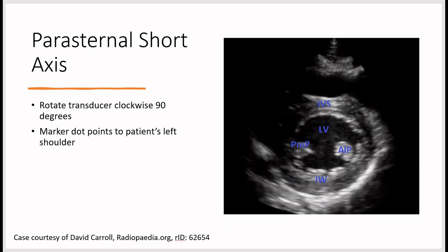For the parasternal short axis view, rotate the transducer 90 degrees clockwise from the parasternal long view, with the probe marker pointing to the patient's left shoulder and appearing on the right side of the screen. Structures visible include the interventricular septum, left ventricle, inferior wall, anterior lateral papillary muscle, and posterior medial papillary muscle. When you see the two papillary muscles — also known as the two punching bags — it's a good spot to assess LV function.